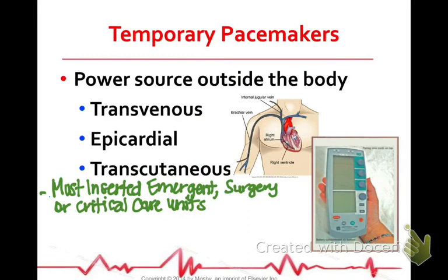So what are temporary pacemakers? Temporary pacemakers just mean that there's a power source outside the body. You can see in the picture, that's the power source. Usually it's like a handheld power source. Can be transvenous, epicardial, or transcutaneous.